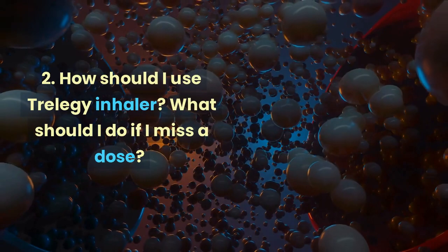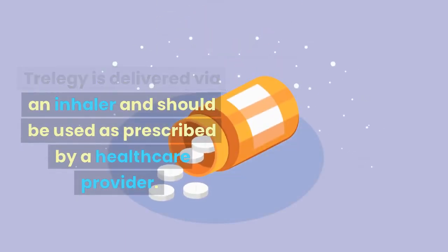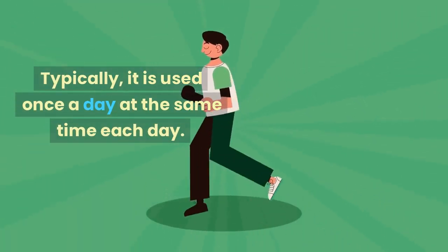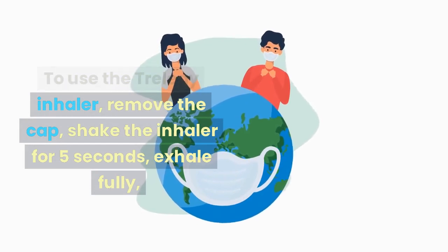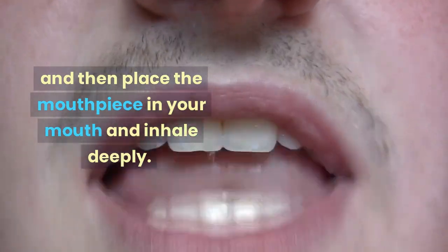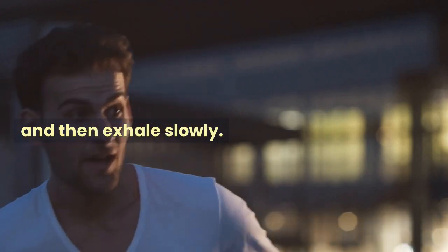2. How should I use Trelegy Inhaler? What should I do if I miss a dose? Trelegy is delivered via an inhaler and should be used as prescribed by a healthcare provider. Typically, it is used once a day at the same time each day. To use the Trelegy Inhaler, remove the cap, shake the inhaler for 5 seconds, exhale fully, and then place the mouthpiece in your mouth and inhale deeply. Hold your breath for at least 3 to 4 seconds, and then exhale slowly.